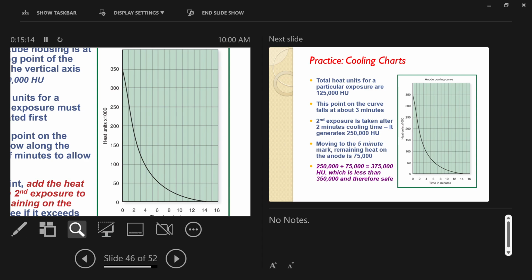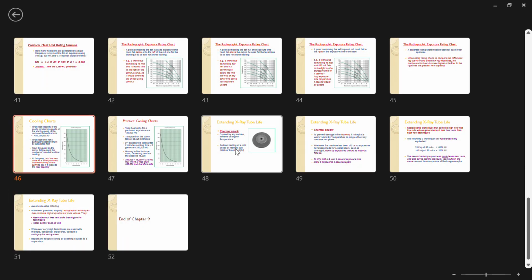So you said a key word, you said when you max out your machine. So just on this graph, 350 would be, on the machine that we use over at the site that I'm at, it'll tell you right there how much of a percentage it'll go up, as far as how hot the machine is. Really? It takes a couple minutes, literally, like say if we're doing torso, lumbar, or thoracic spine, it's going to get a lot hotter than if it was doing a hand or a foot x-ray. So there's a little percentage on the machine.